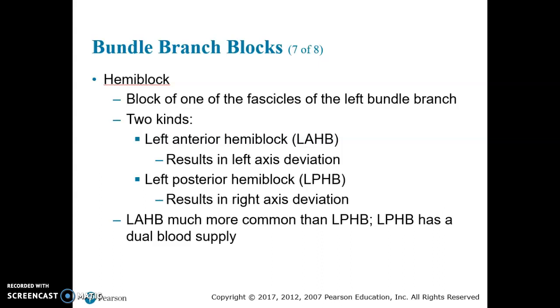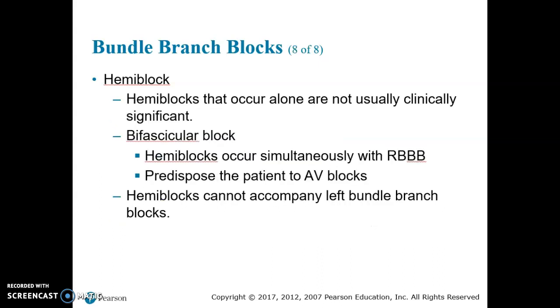With the hemiblock, one of the fascicles of the left bundle branch, again, we have, I think this is what I just went over. I'm sorry. Let me scroll to the next one.